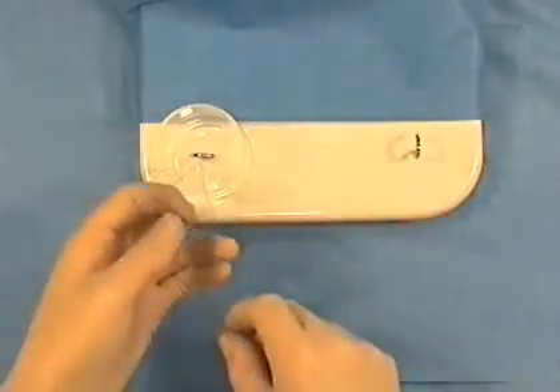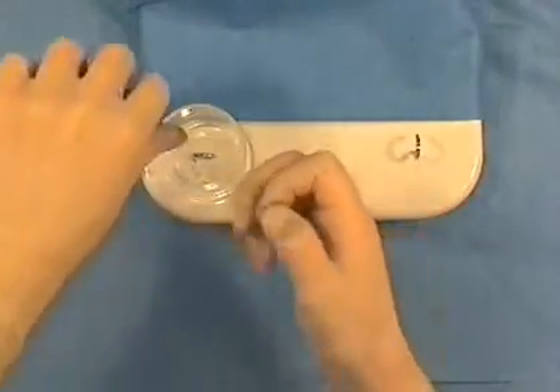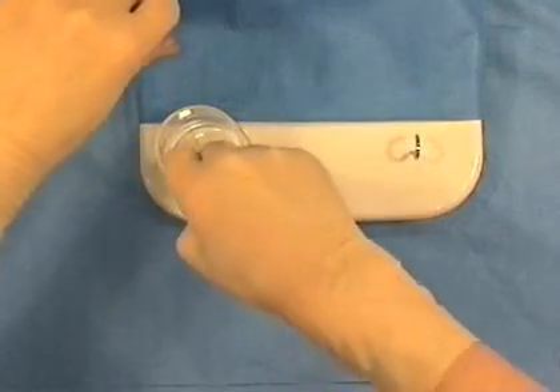The knot should then be tied gently with one finger passing beyond the blood vessel.